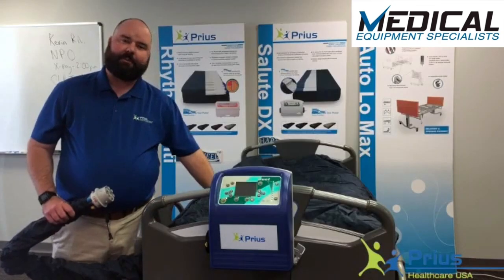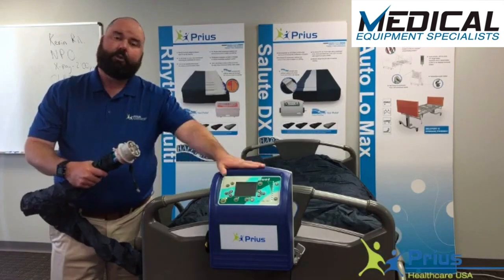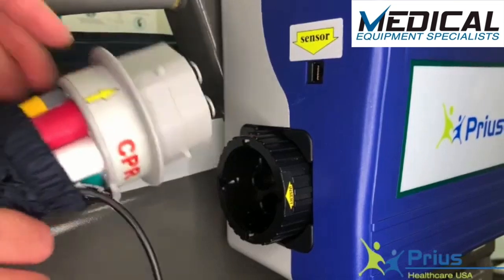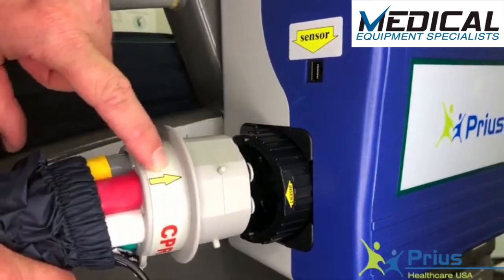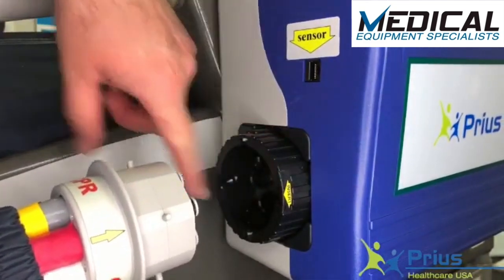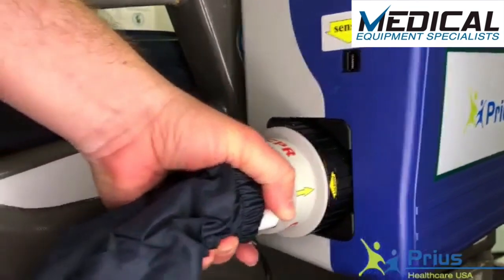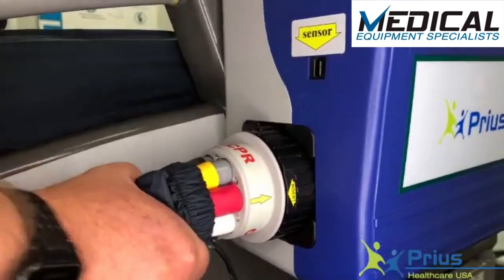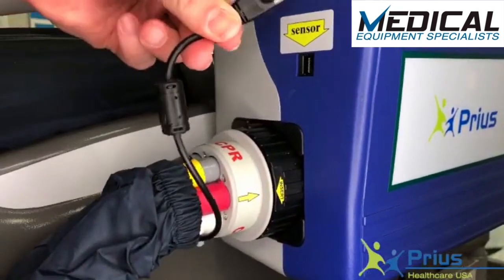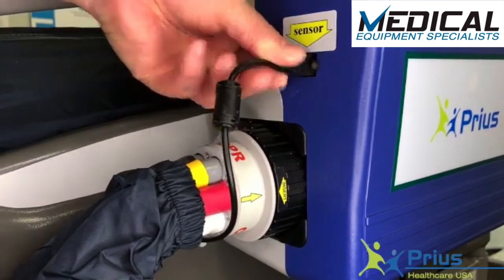Once the mattress has been strapped down to the bed frame, the next part is to connect the mattress coupler to the control unit itself. To connect the mattress coupler into the control unit, you're going to want to line up the yellow arrow with the insert indicator on the air outlet plate itself. Once those are lined up, it'll fit in like so with a tight fit. The other thing that needs to be engaged is the sensor cable — much like an ethernet jack — that will plug right into the side of the unit.